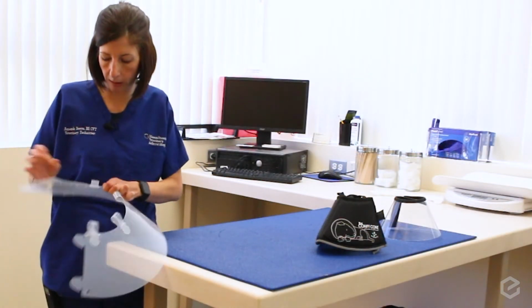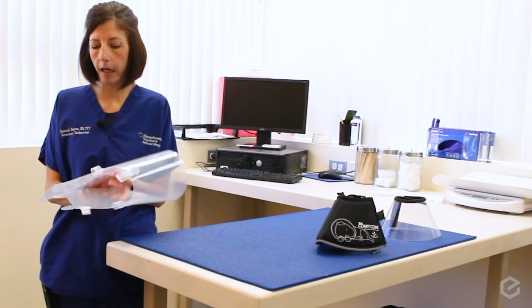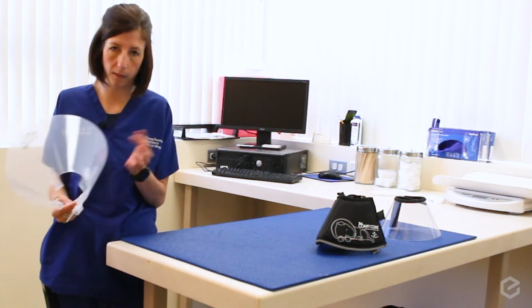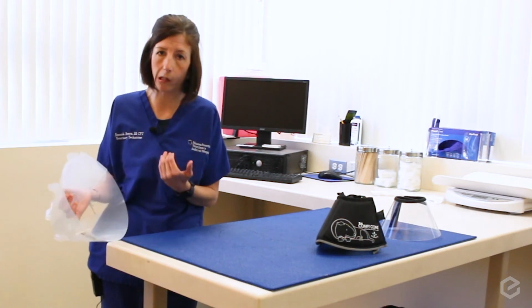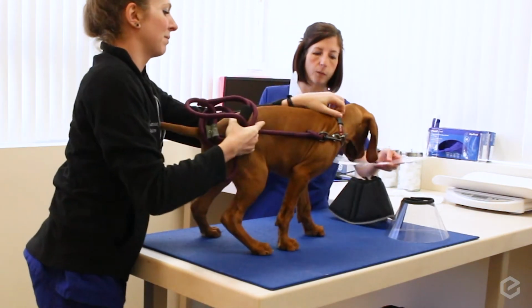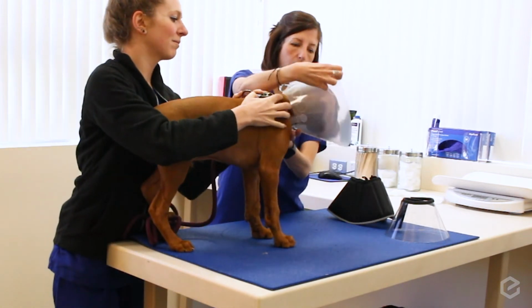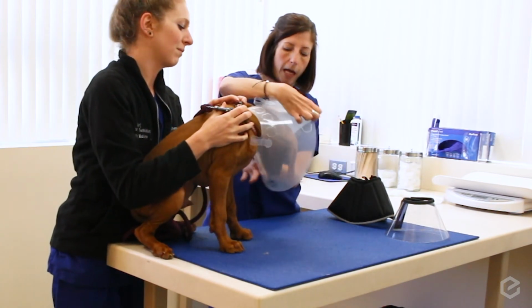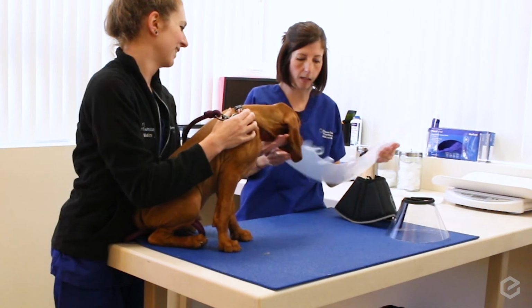The next step would be to make sure that it's the appropriate fit for your pet. We want to make sure that the nose of the patient does not go too far out, as it will defeat the purpose of putting an e-collar on, as they'll still be able to get around it and do any damage to the area that's affected that we need to keep them away from. So what we do is we just gently wrap it around just to make sure that you can see the nose isn't going to slip outside the rim of the e-collar. They shouldn't be able to turn their head and get at any area that they need to stay away from. So we know that this is going to fit appropriately on him.